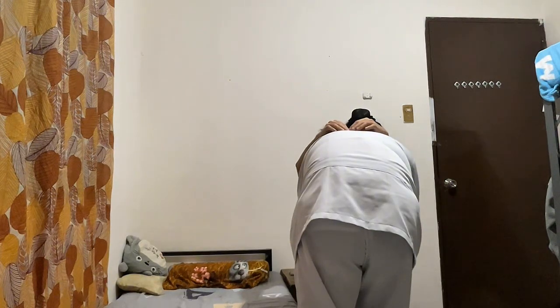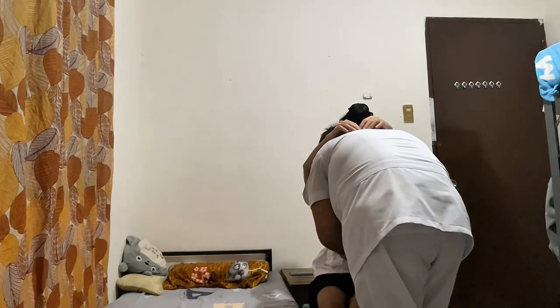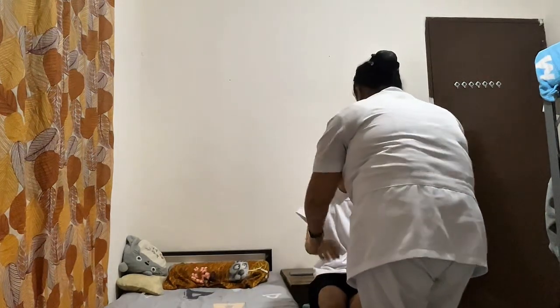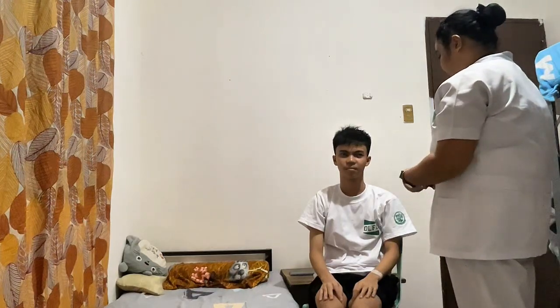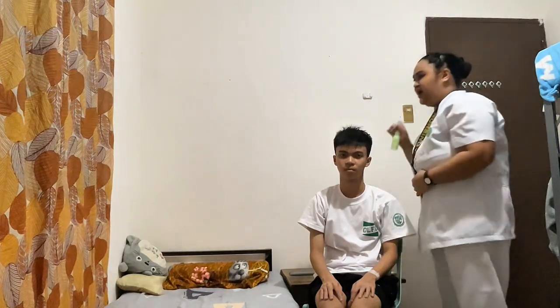I'm now done with the transfer of the patient. I will now unbuckle the transfer belt and allow the patient to remove his hands from my back. Sir, do you feel any discomfort right now? So, after transferring the patient from bed to chair, since I am done with the procedure, I will now proceed with the hand hygiene.